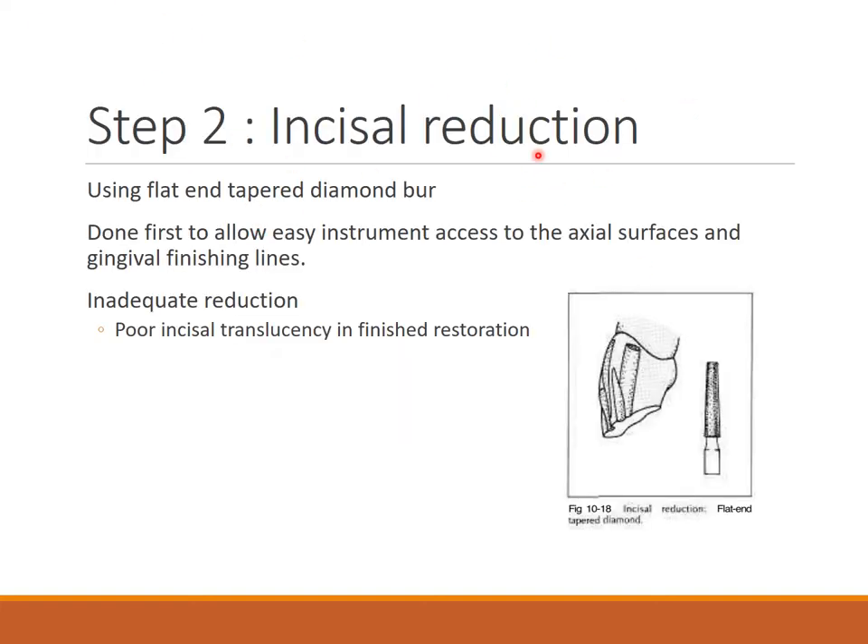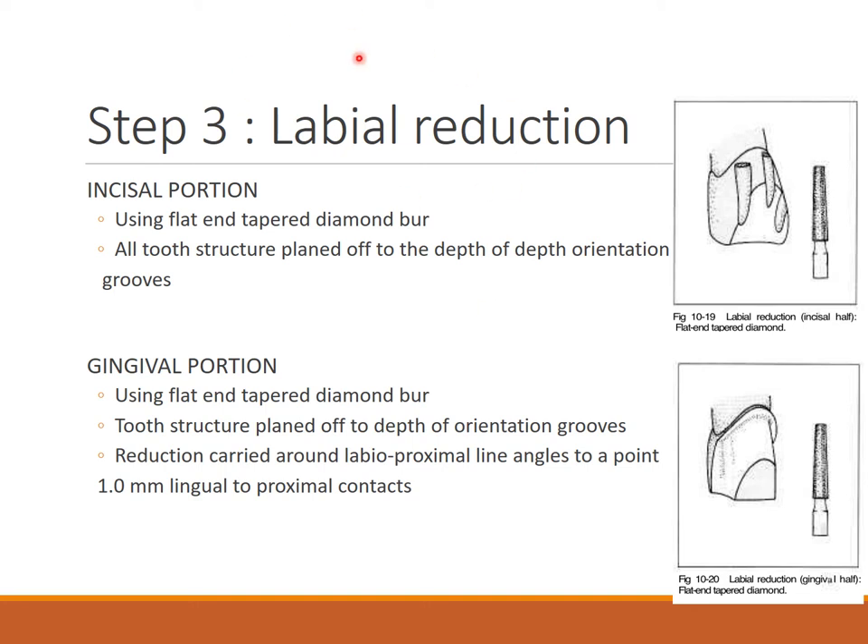Step two is incisal reduction using a flat and tapered diamond burr. This is done first to allow easy instrument access to the axial surface and gingival finishing lines. Inadequate reduction will cause poor incisal translucency in the finished restoration. We need sufficient incisal clearance.